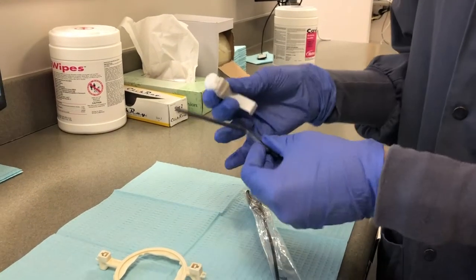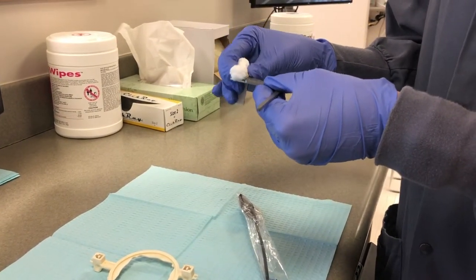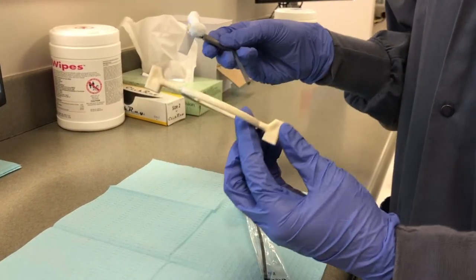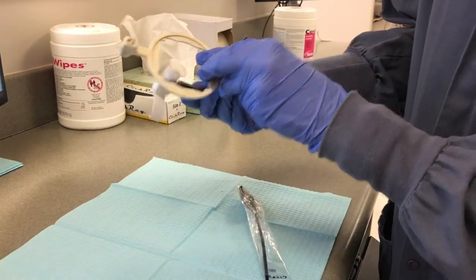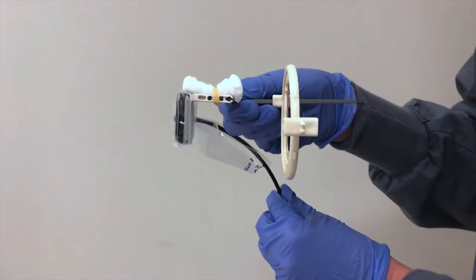For assembly, the posterior bite block should be placed onto the posterior rod. Then slide the offset aiming ring onto the rod. Correct placement will show the posterior bite block centered within the opening as shown here. This allows for correct angulation and the prevention of cone cut when the radiograph is taken.